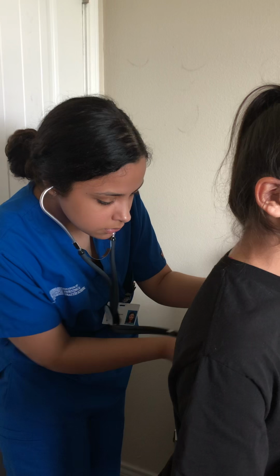Hello. Go ahead and get started by sanitizing my hands, making sure I'm nice and clean. So I'm going to be using a stethoscope today to listen to her lung sounds and her heart. And I went ahead and provided privacy.